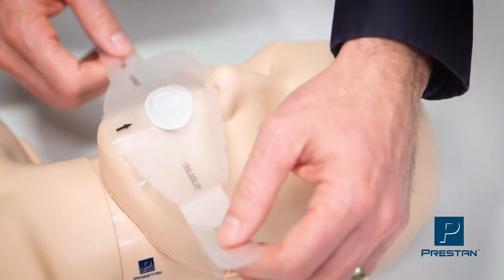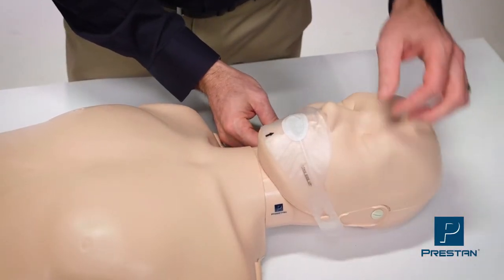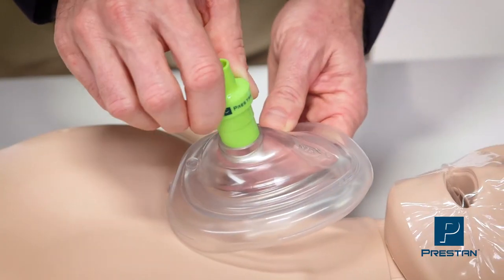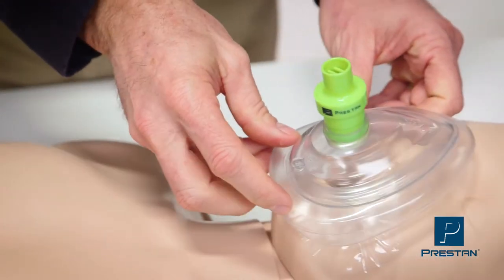If students will be sharing a mannequin, you can provide individual Prestan face shields, which secure to the ear pins. Or if you're using a CPR training mask, Prestan offers CPR training valves.